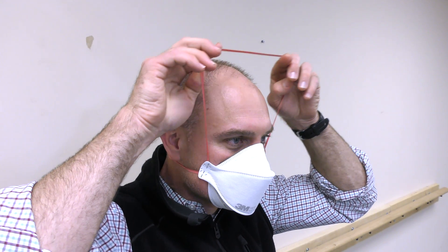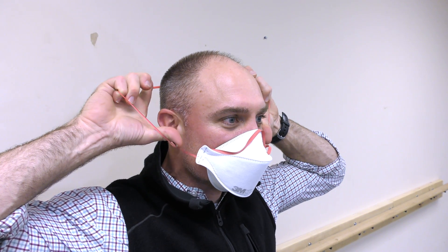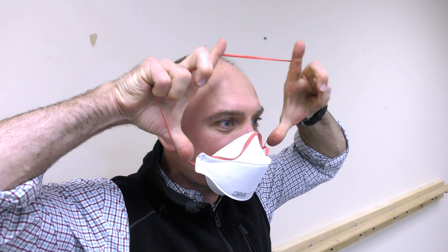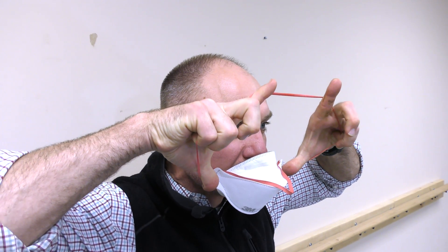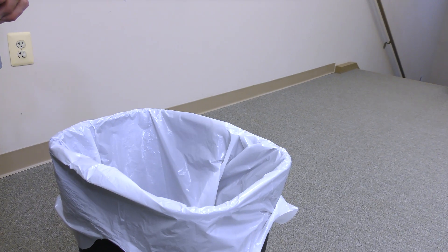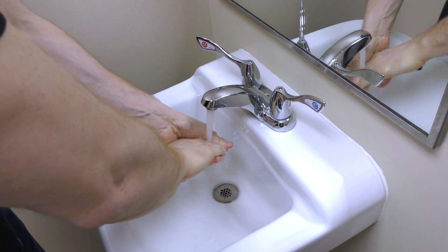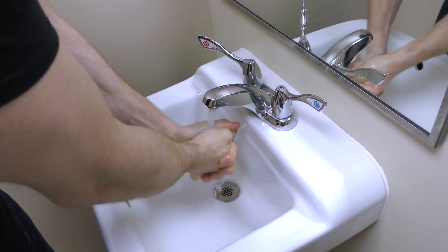To remove the mask properly, slowly lift the top strap from around your head while keeping the mask seated against your face. Do not touch the face piece, which may be contaminated with viruses trapped on the surface from use. Lift off the bottom strap and carefully remove the respirator without allowing the outside of the mask to come in contact with your body. Dispose of the mask if it is damaged or contaminated with blood or body fluids. Wash your hands.